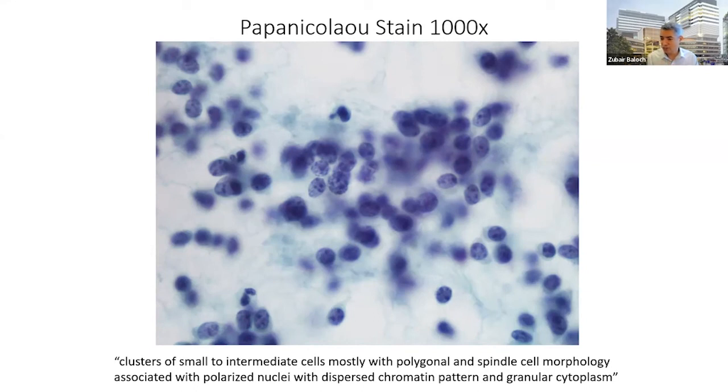You don't need a pathology residency. You look at those cells and you say, that cell looks bad. So anaplastic carcinoma will have that. Plus you will have a necrotic background, because most of these giant anaplastic carcinomas will have necrosis in the background, and sometimes you can even see mitosis. So that will be missing in that spindle. So it's clean spindle cells, because necrosis is not that common in medullary. You do see it, but not that common on FNA specimens.